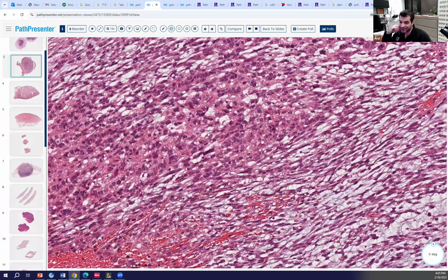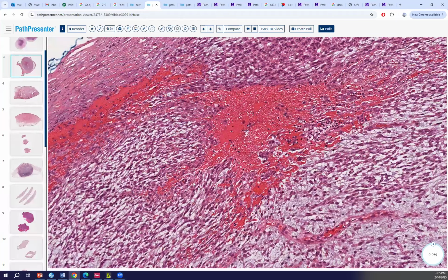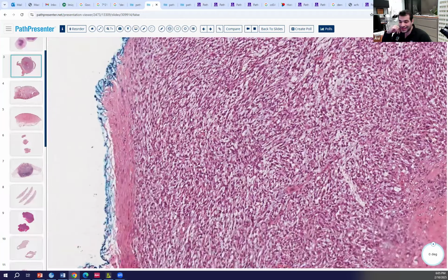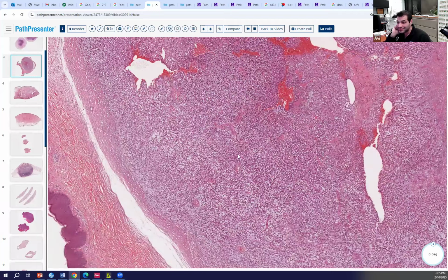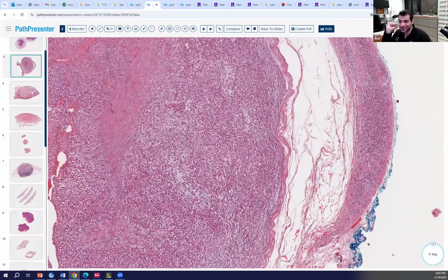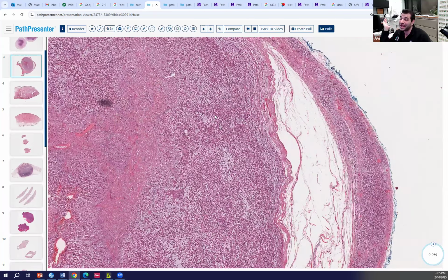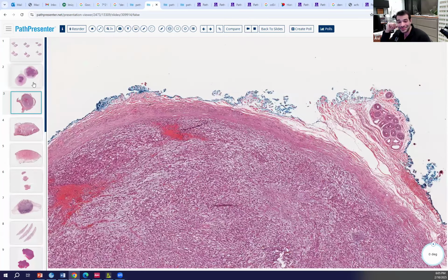That's another feature that's been described. But it's not a coincidence that they resemble each other. In fact, the Elstonism cheat code for schwannomas is just capsule with subcapsular edema. You're done. Don't even look for the Antoni or anything else.